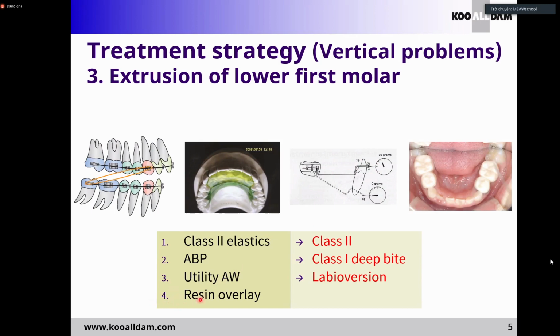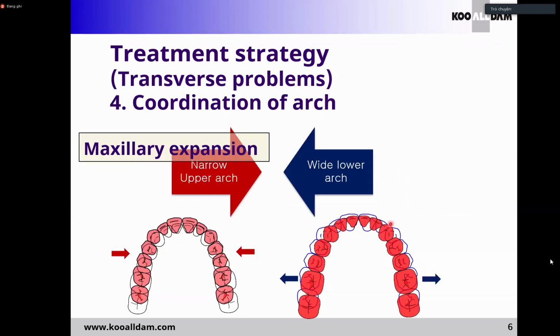The first factor is resin overlay. And also, first, especially in the narrow upper arch, we want to expand the upper arch. So this means coordination of the upper and lower arch.